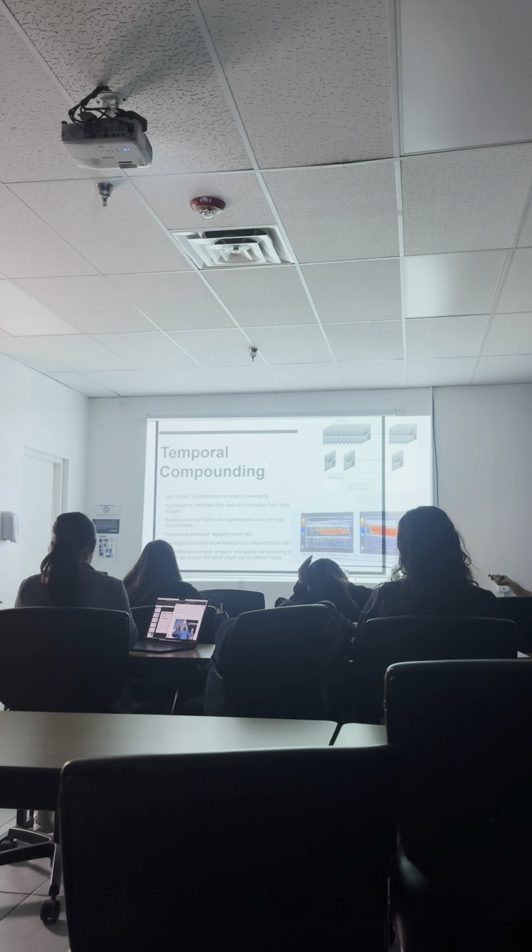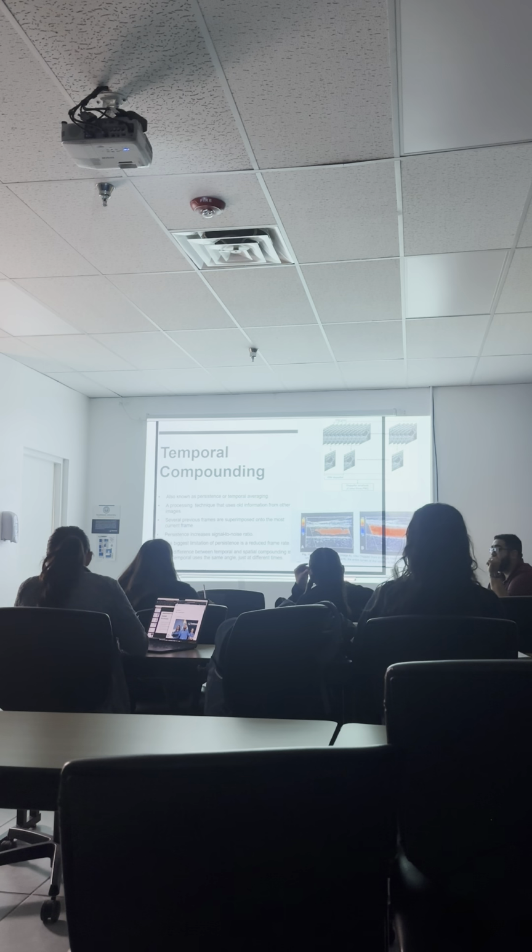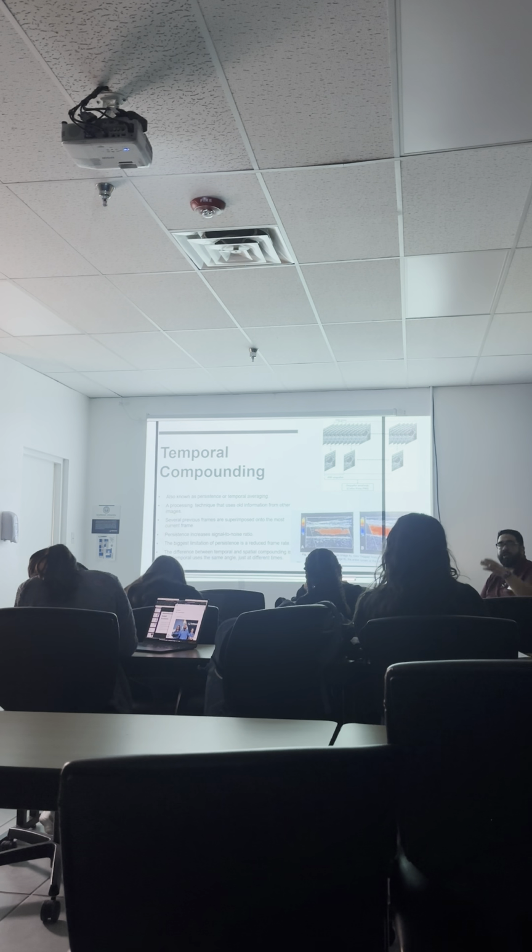Okay, so persistence increases the signal to noise ratio. So what does that mean? It overlaps, so it increases the amount of useful information. And if you increase one thing, the other thing has to decrease, right? So it increases the amount of useful information.